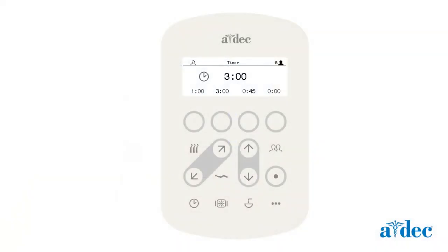For non-handpiece modes, such as timers and flush, the behavior is slightly different. Pressing the Adjustment button enters the Adjustment function, where a user can make a change using the chair base up or down arrows. This is followed by a touch and hold of a soft key to save the new value. The user can then press the Adjustment button again to exit.